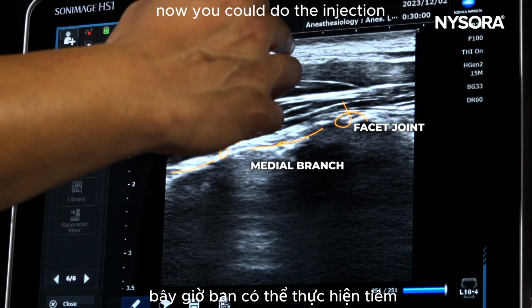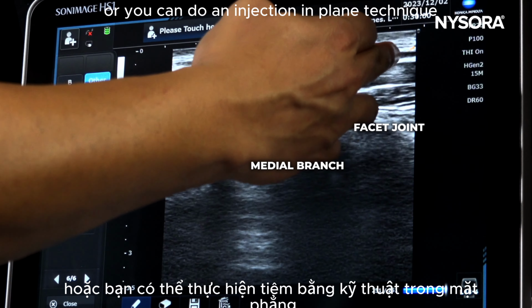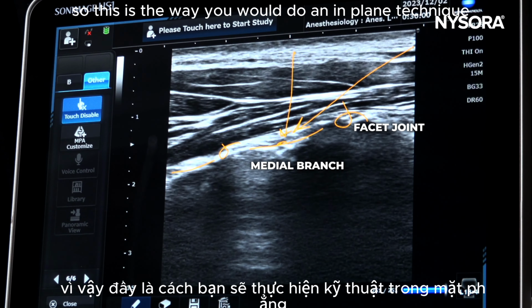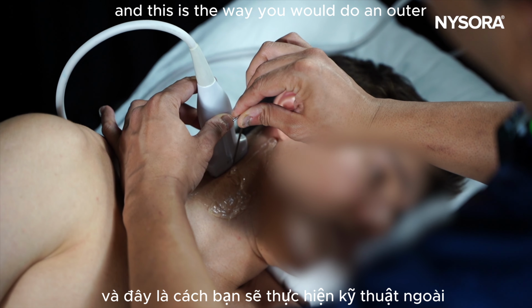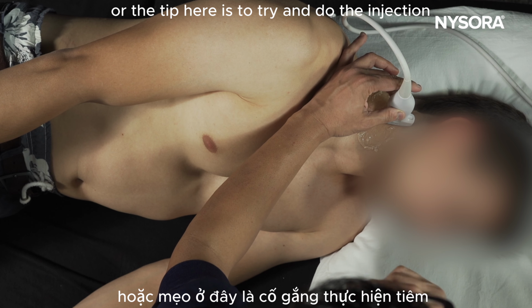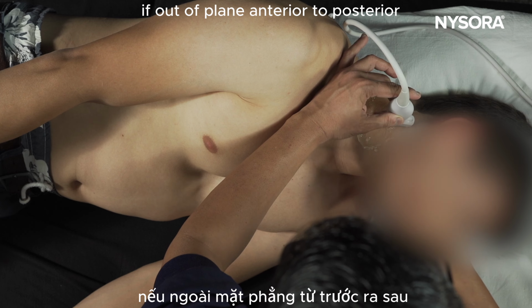Now you could do the injection with an out-of-plane technique, or you can do the injection with an in-plane technique from superior to inferior, or cephalad to caudad, and I'll show you with the pointer here. So this is the way you would do an in-plane technique, and this is the way you would do an out-of-plane technique. When you want to do this injection, always remember the clinical pearl, or the tip here, is to try and do the injection, if out-of-plane, anterior to posterior.